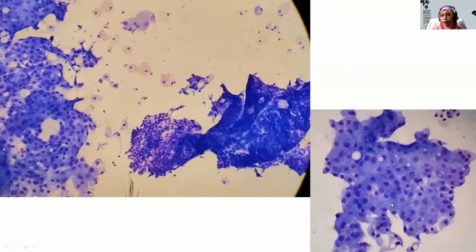The apocrine cells look organized with round nuclei. However, some cells look a little larger with prominent nuclei, but still it doesn't look malignant.